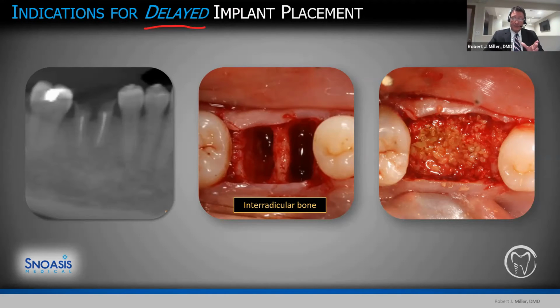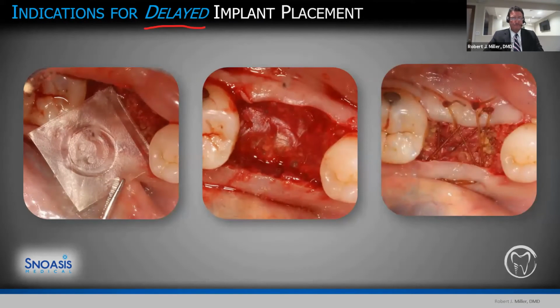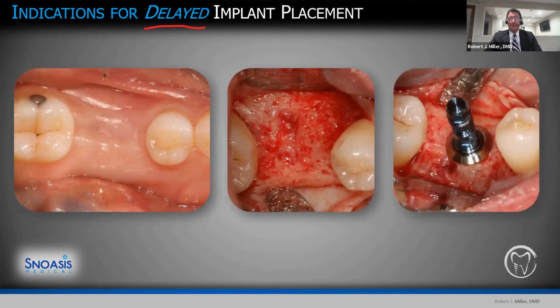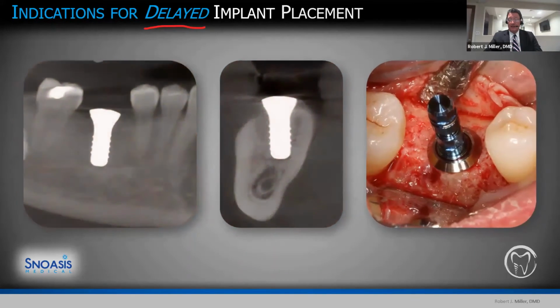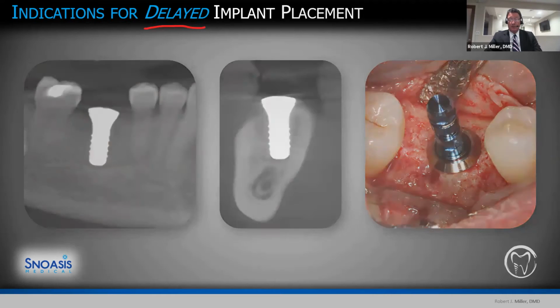Now, what I opted to do was place my freeze-dried bone allograft. I used a BioXclude membrane on top of that, closed over, allowed it to heal for about 3 to 4 months. We opened up the area and we have complete 100% regeneration of that site, which enables us to place a dental implant in a very predictable, prosthetically guided position, which again, I think is the overwhelming reason to do this particular case, and it's a two-stage, using a staged approach.